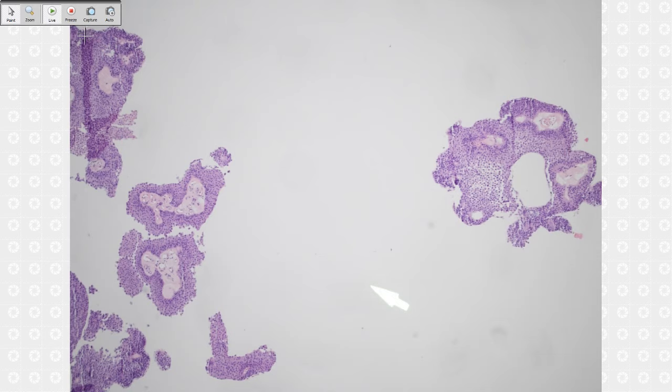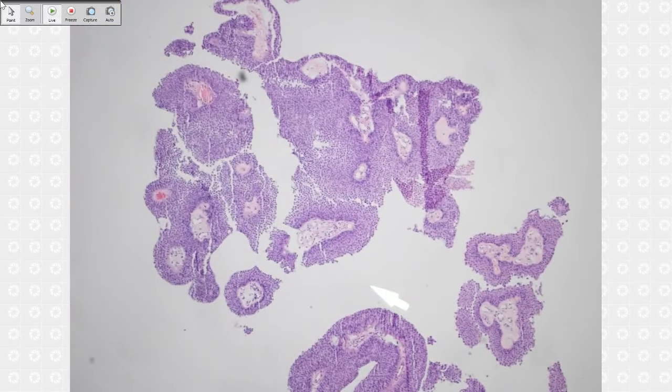If we saw lamina propria invasion, or even if not, we have to document muscularis propria either present or absent, right? Tell the clinician you didn't get detrusor muscle. Especially for TURBT, for biopsy, probably they will go back for more resection. In that setting you should pay more attention. So this one, agree, right? This is low grade, right?